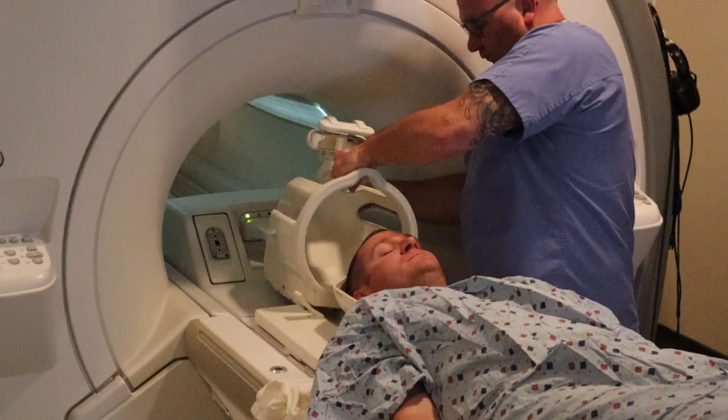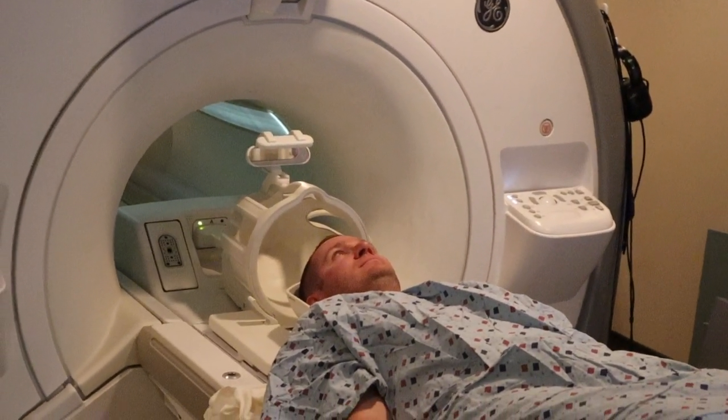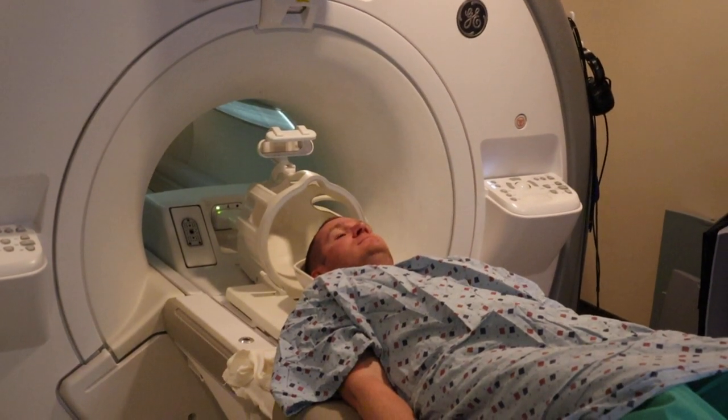He's connecting it to the doghouse. At all times you want to make sure that the patient knows what's going on, to remain still and as comfortable as possible.